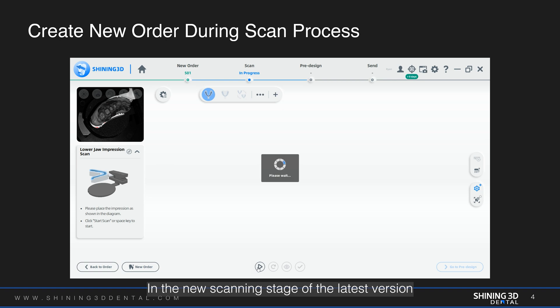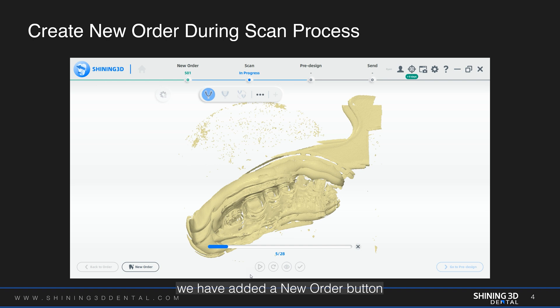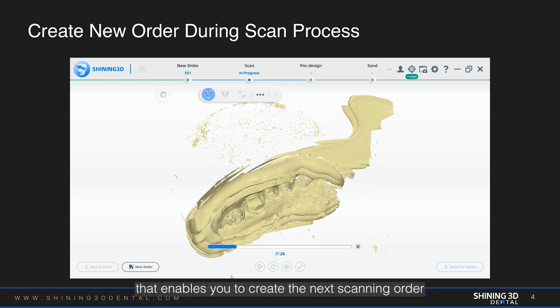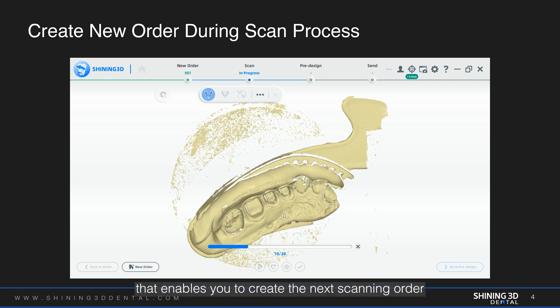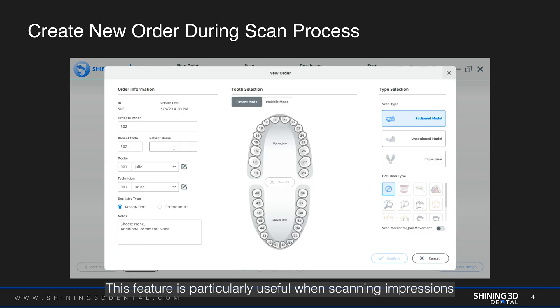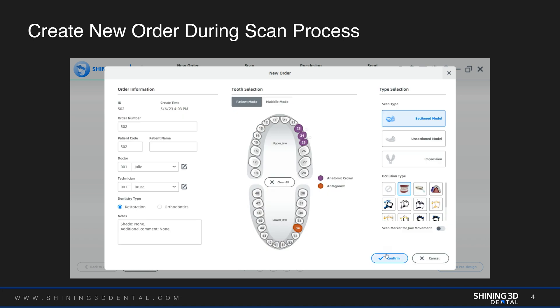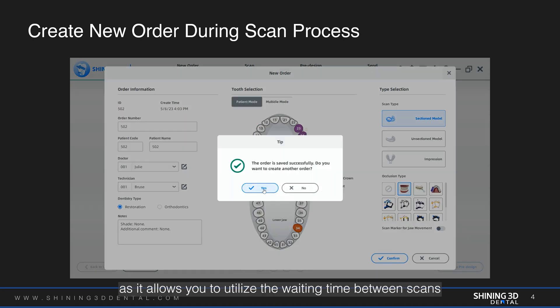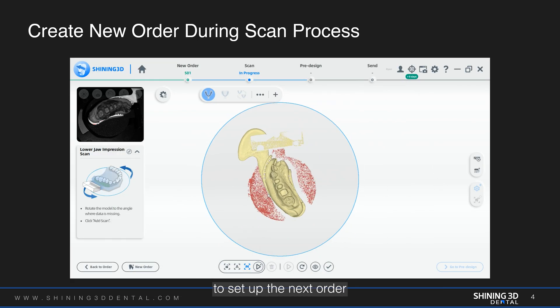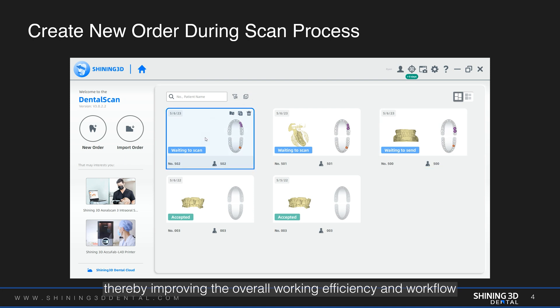In the new scanning stage of the latest version, we have added a new order button that enables you to create the next scanning order while the ongoing scan is in progress. This feature is particularly useful when scanning impressions that require capturing a large number of images, as it allows you to utilize the waiting time between scans to set up the next order, thereby improving the overall working efficiency and workflow.